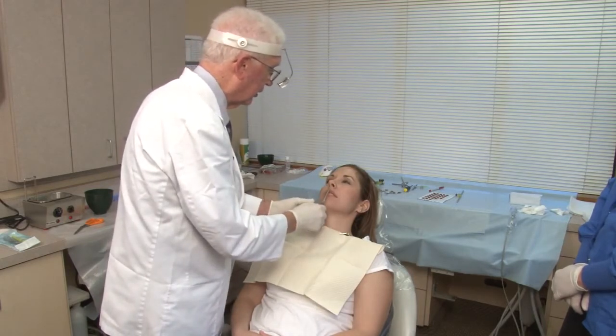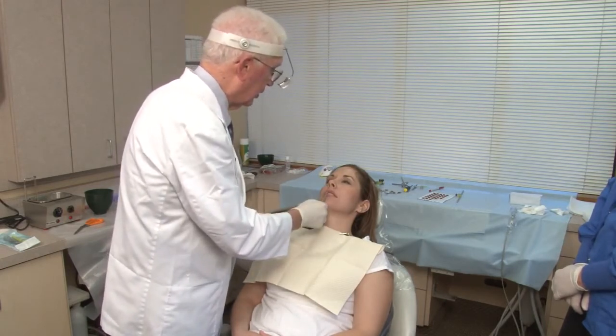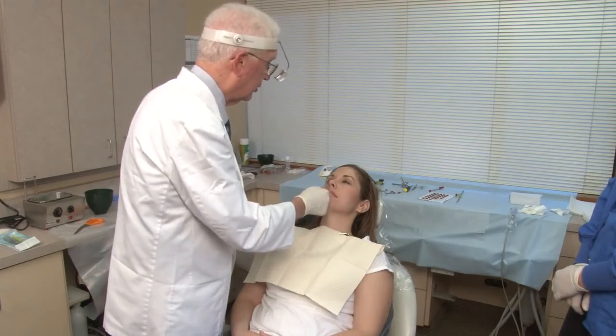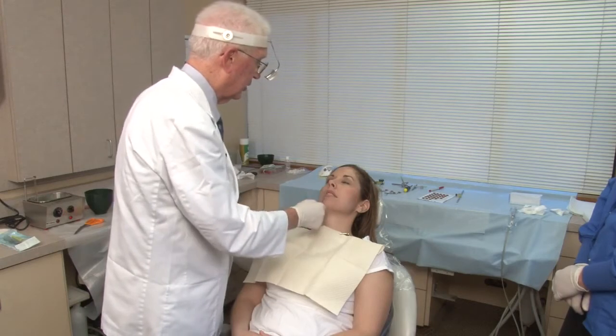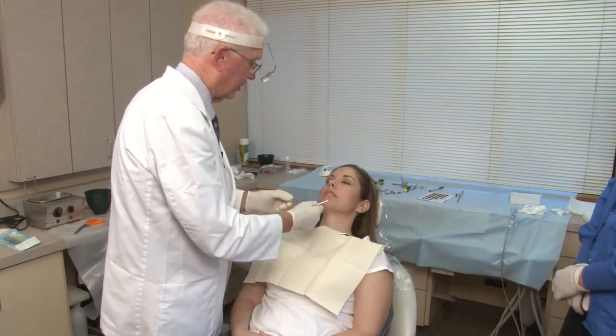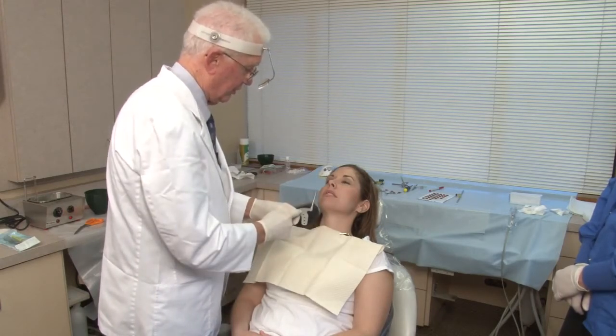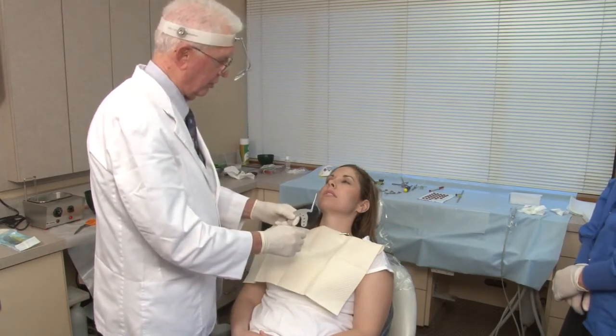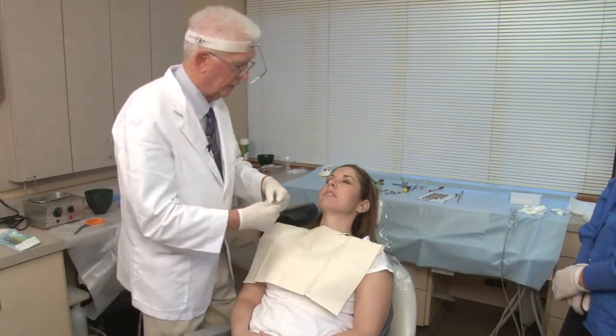See here, look here. And then look at the upper teeth, and you see the two line up. So she lines up, she's very symmetrical, lines up very nicely. So when I place my bite fork now, looking at the midline on my bite fork, I can look at the midline of the teeth. And that way I know I'm on the skeletal midline of the patient.